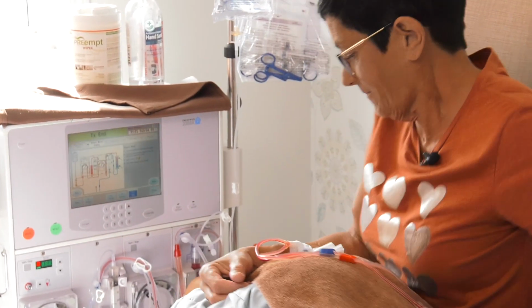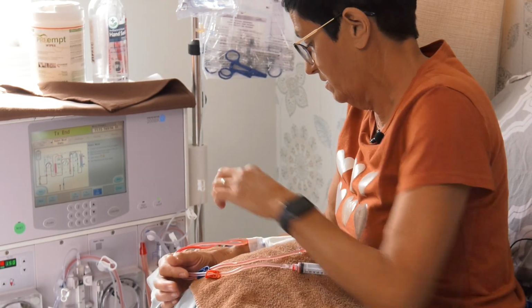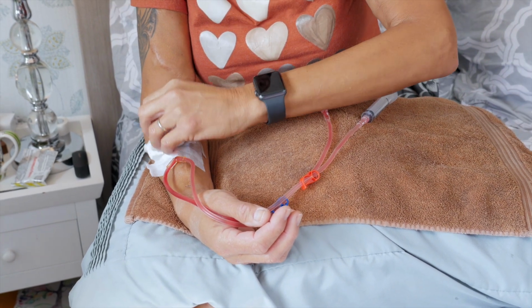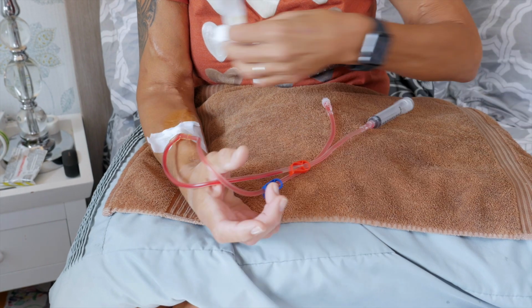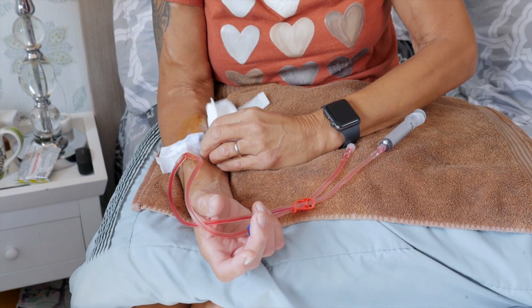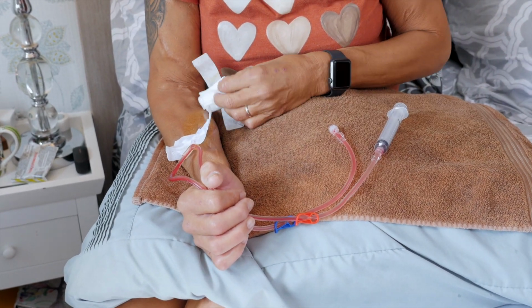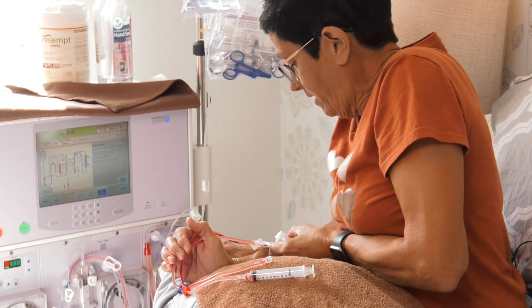Now I'm going to pull my needle. So when you're pulling your needle, put your line in between your thumb and your pointer finger. And I like to have my gauze already taped down, so it's a little easier to maneuver if it's taped already. Carefully peel your tapes back, holding your line so you're not pulling it out until you're ready. Okay. And then you pull it a little bit, and then out she comes.